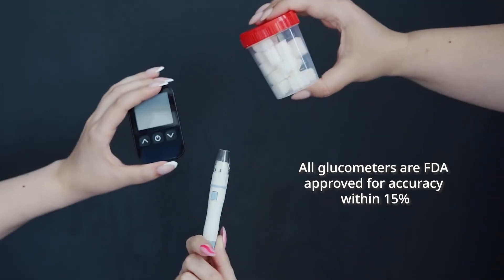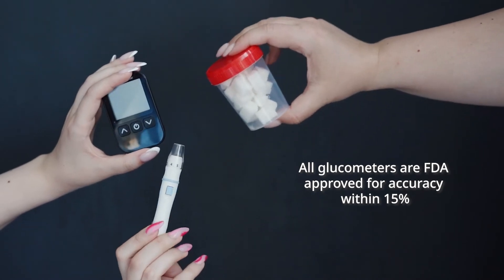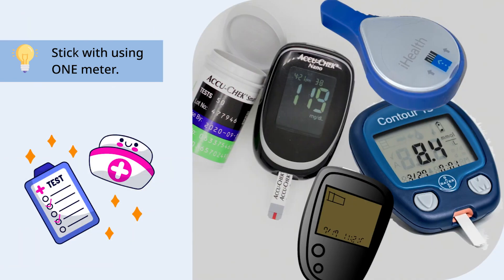Note that all glucometers are FDA approved for accuracy within 15 percent, and all will have a different algorithm, so don't compare one meter's results to another since they're almost always going to be a little bit different.